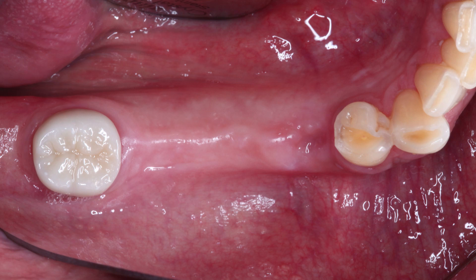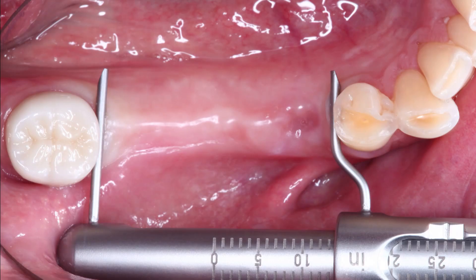When I was presented with this patient, I wanted to go ahead and place an implant. One way of doing that is to take measurements of the ridge utilizing a measuring device. I took my measurements, did the math, and I can place three Hahn implants in these locations. For a situation like this, my first recommendation is to take an impression and have the laboratory fabricate a surgical stent based on a diagnostic wax-up, which will make it a lot easier to place the implants in the proper location. That was going to be a little bit tricky because the patient had a defect in the area of 29, so just having a surgical stent would not have been enough. We free-handed the implants, and I was confident I would be able to get the implants in a fairly parallel situation.